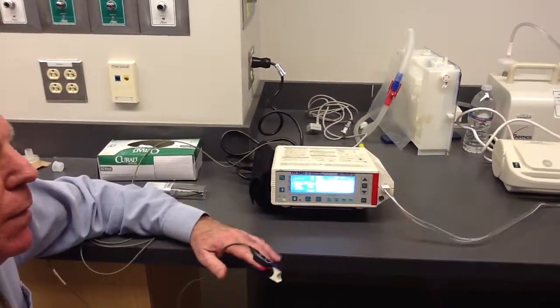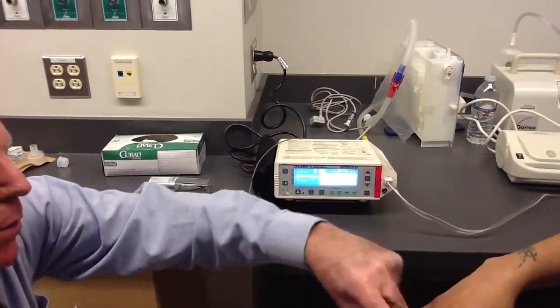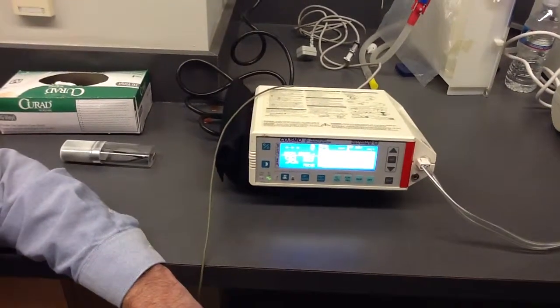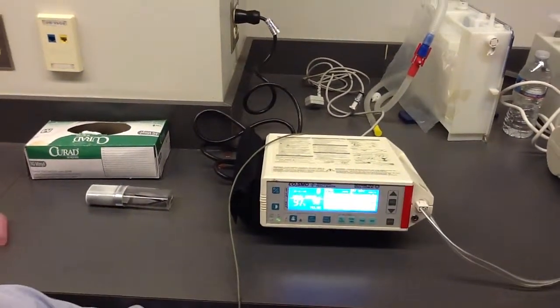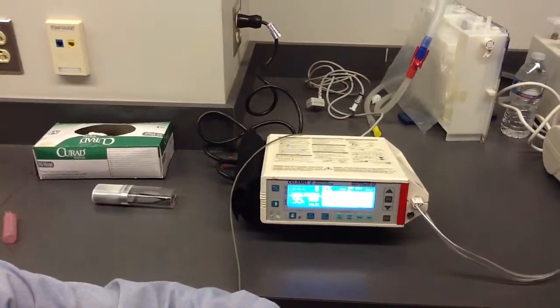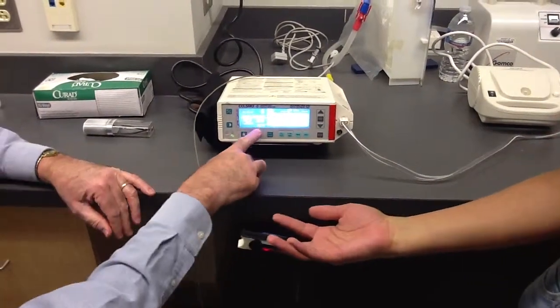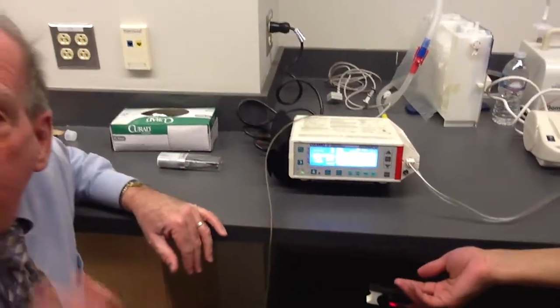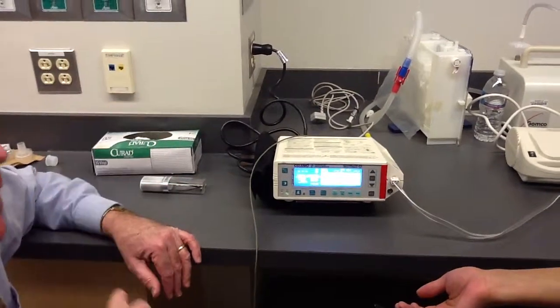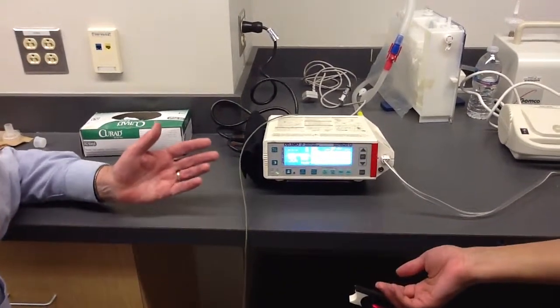Because it's giving a pulse ball — a wave with each one. Give me your finger, please. Turn your wrist over for a second; I will try not to hurt you. What you will see is I can block out blood flow. This is your basic Allen's test, in case you're wondering. Now, do you believe this number? No. Even though it showed a heart rate and a saturation, you can't believe it because the feedback says: if you don't see a good waveform, then you assume that the machine is not detecting a good pulse, and you just can't report that number.